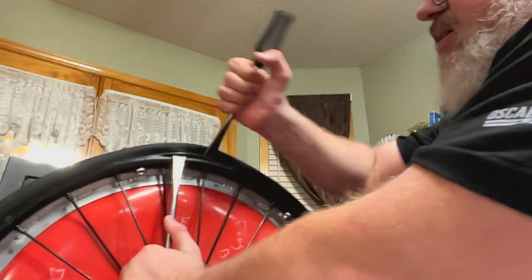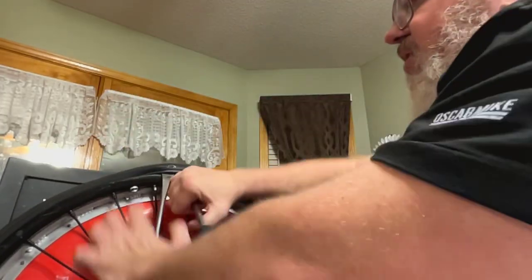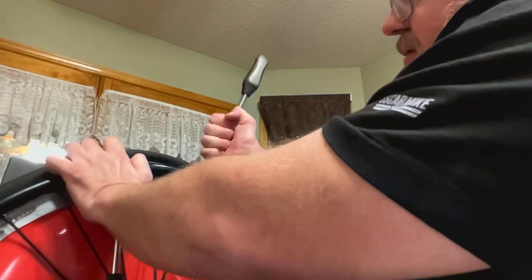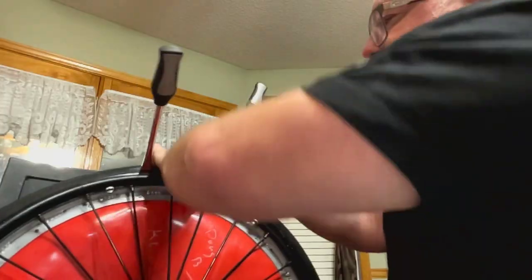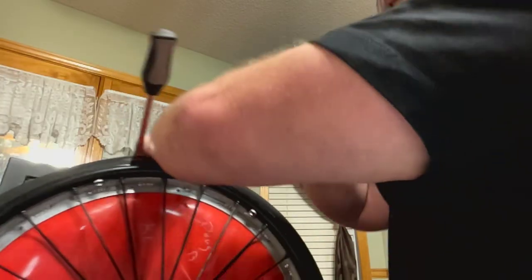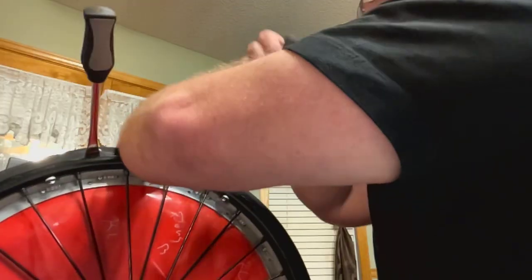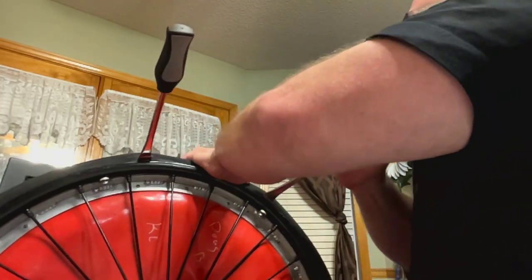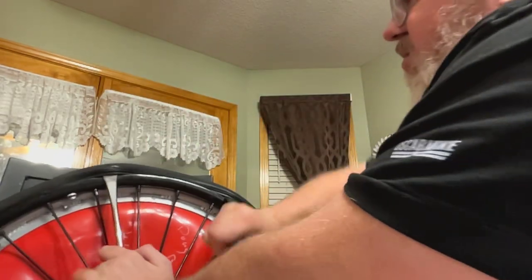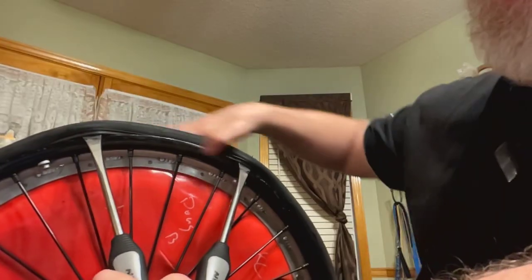Hopefully I did drag the other side of the tire over. And then I kind of start it that way. I go to the next side, go a little bit farther down. Ideally, I want to be far enough where I only have to do this once, but close enough where I can still work the tire over. See, like right here, the tire is not fully separated over.